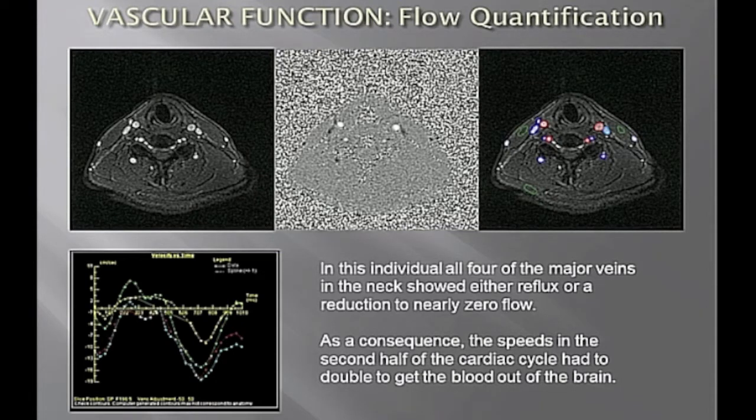So as you can see, there are many veins draining the blood, but there are basically 4 major arteries feeding this. And later on, I'm going to show you an evaluation over 250 people and give you some example distributions of actual blood flows on the arterial side and the venous side. So in this particular individual, we then take a picture throughout the cardiac cycle.